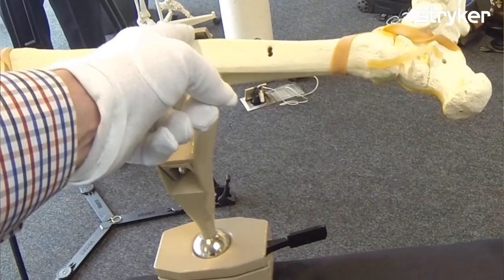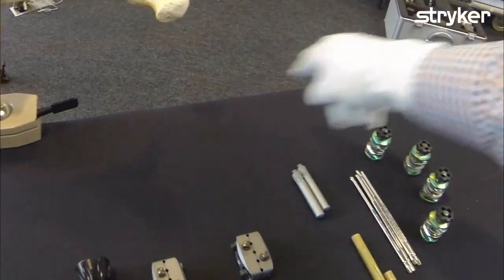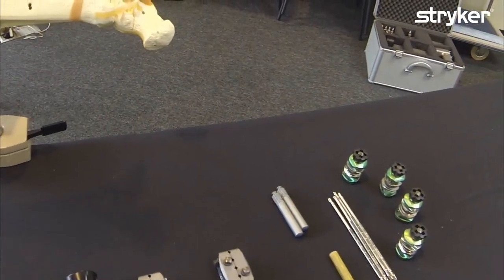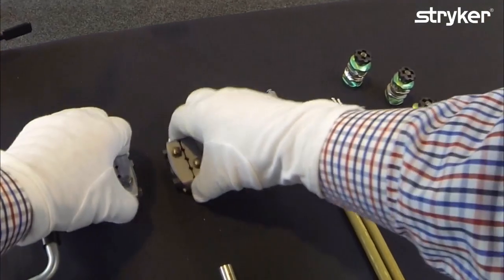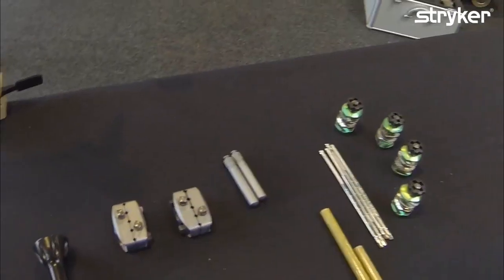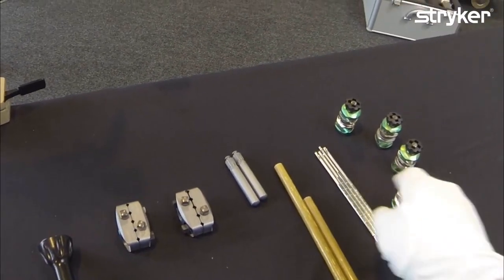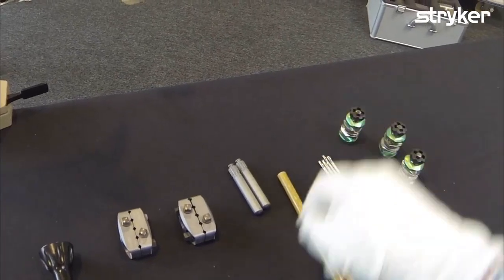We imagine here that there's a tibia fracture right here where the clamp is — a simple fracture or perhaps a comminuted fracture. These are the components you need: two multi-pin holding clamps, two straight side arms, a couple of bars, some pins, and four connectors.